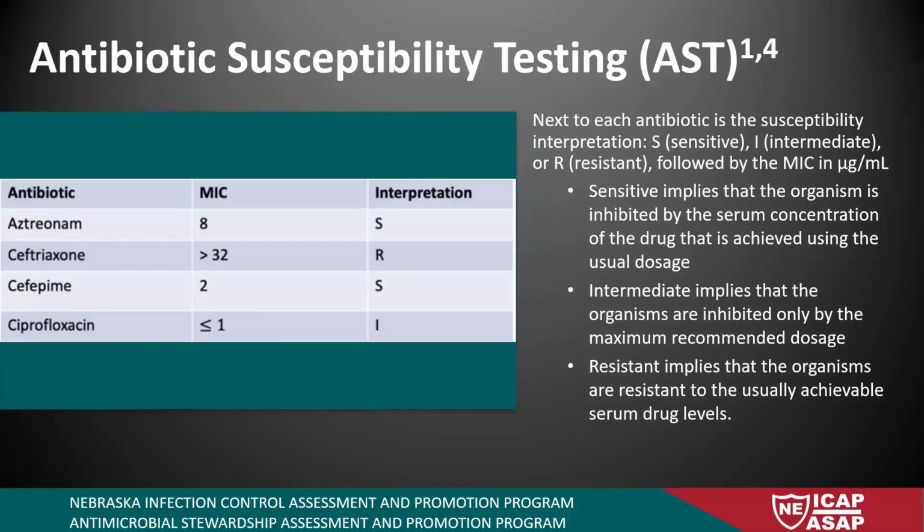But vancomycin, we'll say vanA/B, they usually match. Those go together. But then you get CTX-M, and that goes with ESBLs, and that doesn't really make sense at all in my brain because I did not make that rule. I didn't make up that gene name, but that's why we have a little cheat sheet that can help us identify that.